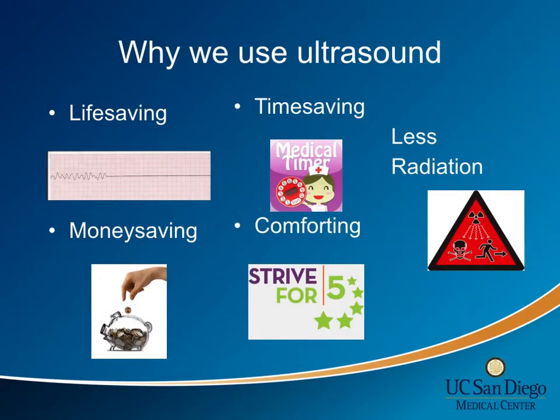Let's start with why we think ultrasound is an important part of our practice. It is an invaluable tool for resuscitation. It is immediately at our disposal and not subject to delays of radiology availability. It is often more cost-effective than other studies. It certainly affords less radiation to the patient, and perhaps most surprisingly, patients really like it.